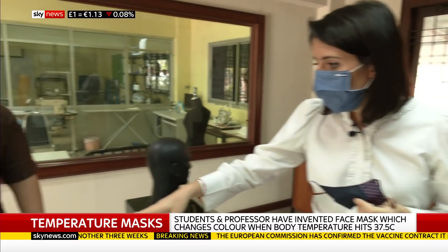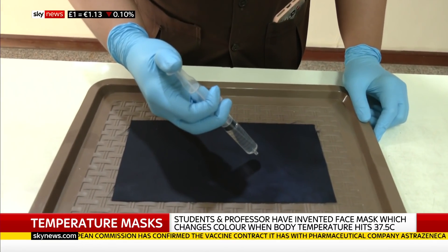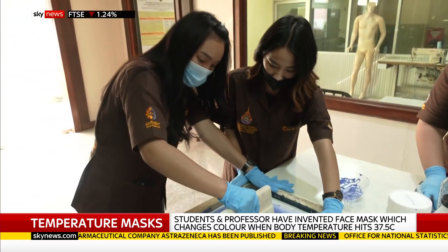Let me show you some of the technology in action. First of all, this is the water-repellent coating. Let's see if it works. Water coming — you can see that's not going through at all. So none of those infectious droplets would be brought into your mask.